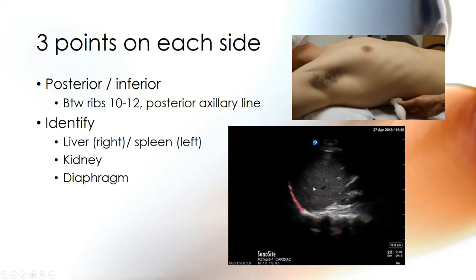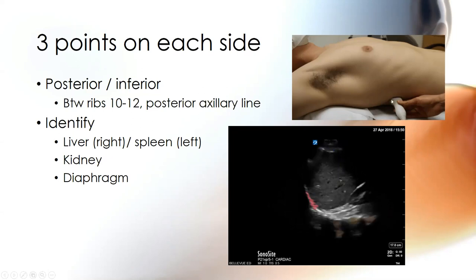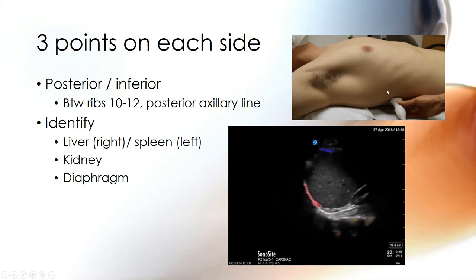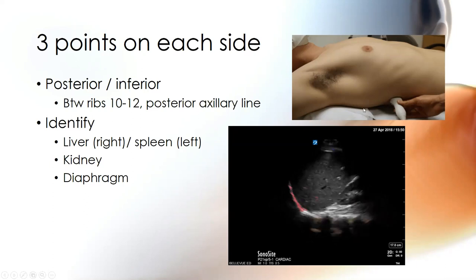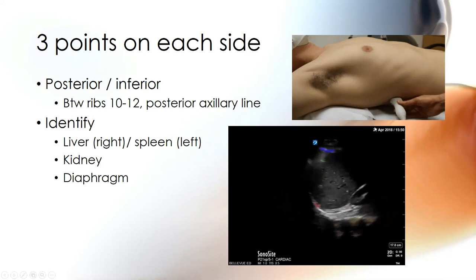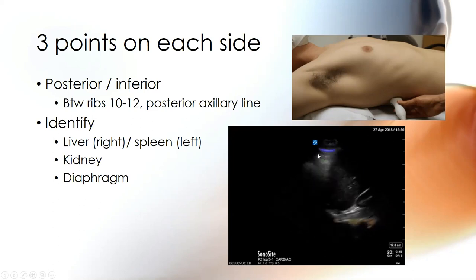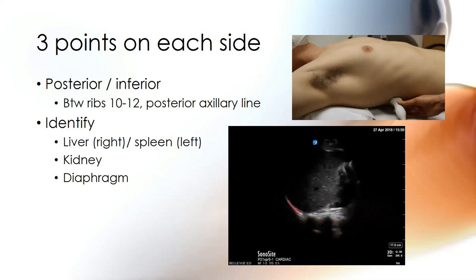You put your probe there, gravity, fluid goes down, inferiorly. If they're flat, it will pile. You can say exactly, yes, they have a pleural effusion, or no. Or they say, oh, let's get a CAT scan of the lung, see if we can tap it. You just put your probe on there and you're like, yeah, no, it's not big enough. I mean, if you've got a really brave, bold doctor that's wanting to put a needle in the chest, I just don't know how much fluid is in there. May not be worth it.